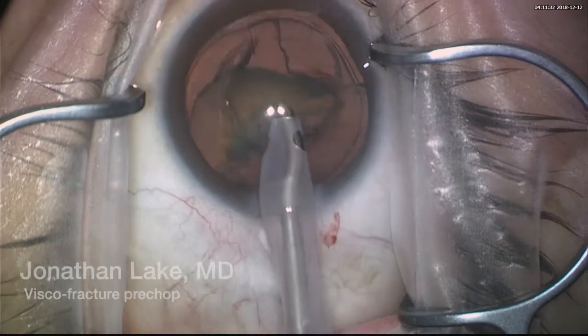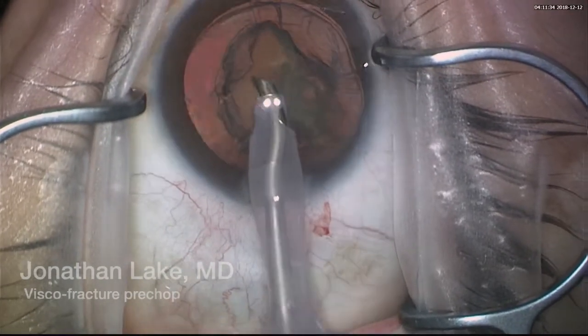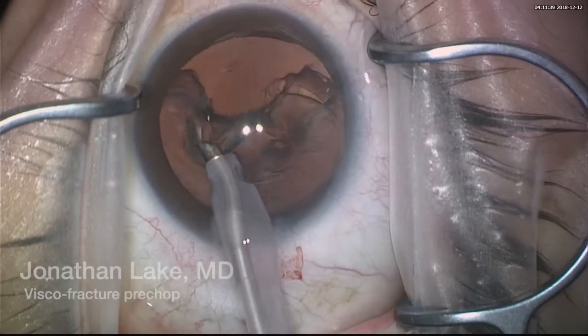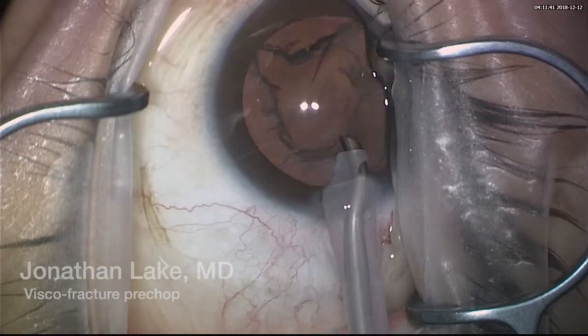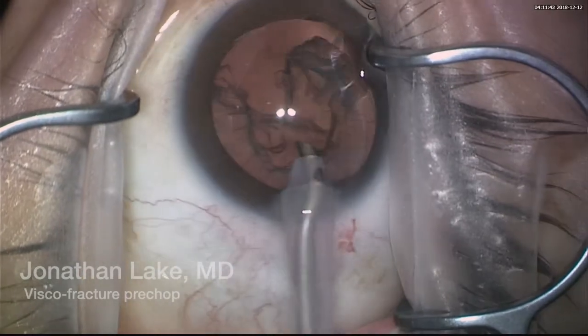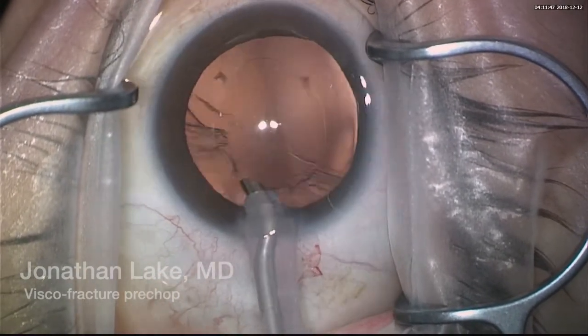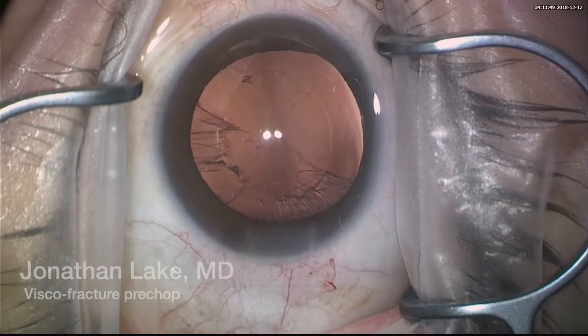We can see a nice grasp along with phacoemulsification aspiration. I like to leave the epinucleus, which I can aspirate, and we can see that there is very little cortex here towards the end.